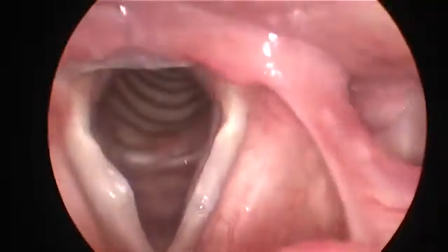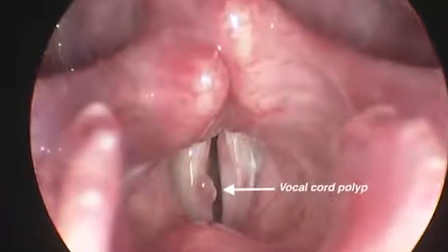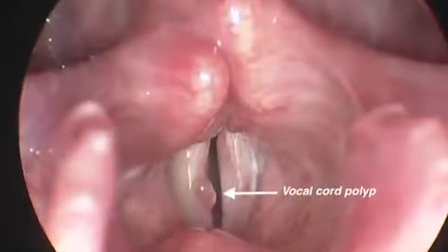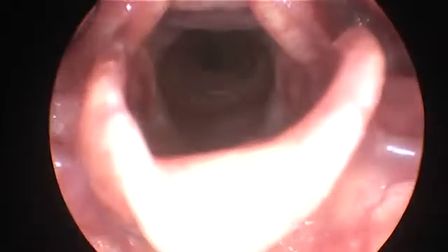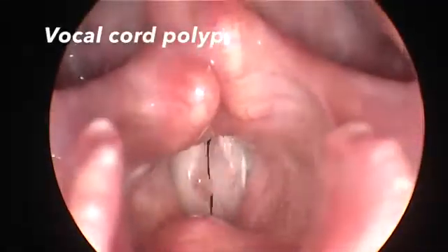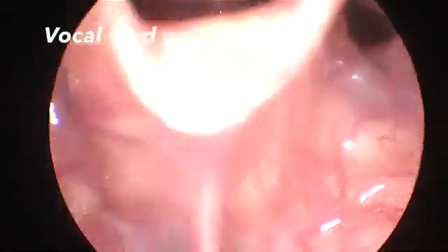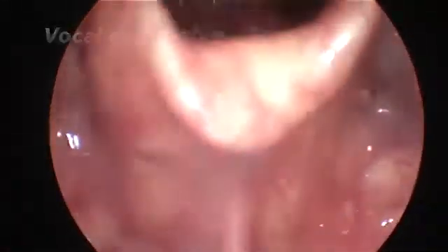Abnormalities like nodules, polyps, scars, and even vocal cord tumors can be identified early and accurately, allowing me to get you on the road to improving your voice faster and more effectively.